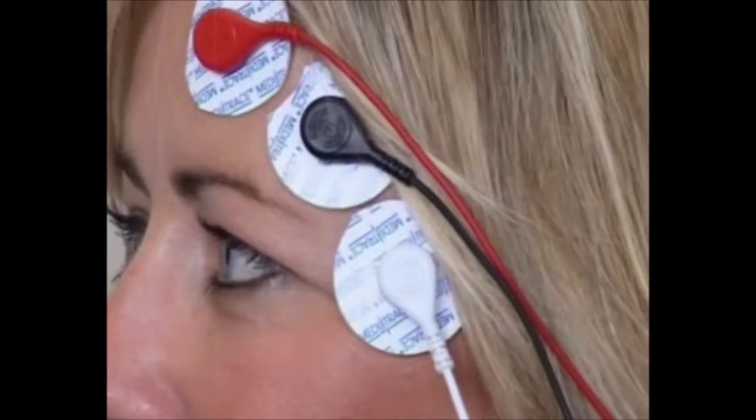We're going to do a demonstration where we're going to look at the intensity of clenching. We're going to look at EMG biofeedback. As you can see, Belinda has got some sensors over one of her clenching muscles. That muscle is called the temporalis muscle. These are surface electrodes, and these sensors will pick up the intensity, the degree of clenching. So we're going to get Belinda to do some clenching and grinding just on her own teeth, and then we're going to compare it to 2 different types of splints and just see the difference to what we pick up.